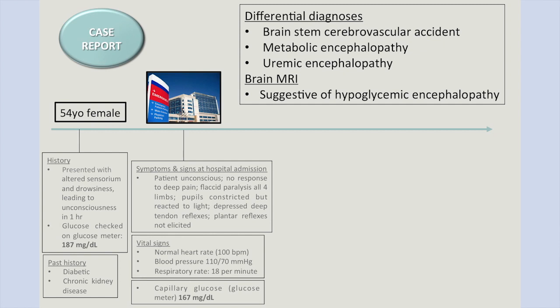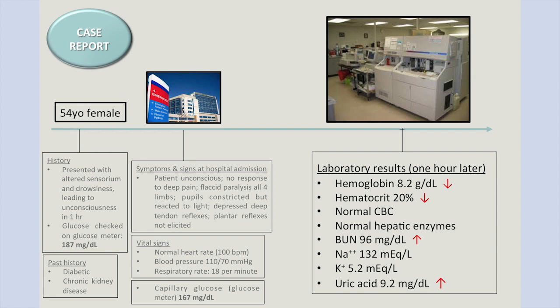Well, at that same time, they had ordered laboratory results, because you don't want to put all your eggs in that one basket of the glucose meter. And what they found was, look at this, a low hematocrit. Building upon what NAM had to say, hematocrit can profoundly affect the results of certain glucose meters. In this particular case, it was low, and as NAM pointed out, a low hematocrit can cause an overreading of the glucose results.